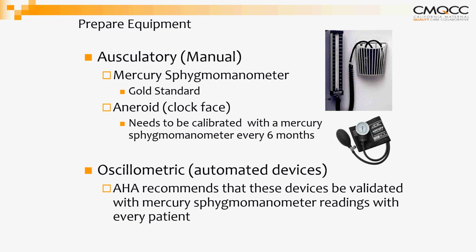So again, we've got a vast array of nursing staff that are on the call. Those of you that I'm familiar with, some of you have been nurses for a long time, so you may be familiar with the older sphygmomanometer, the mercury one that we see in the picture there, and that is the gold standard. And then, of course, as time has modernized, we've seen more newer ones, and most of us perhaps have automated ones that we see in our clinical areas.